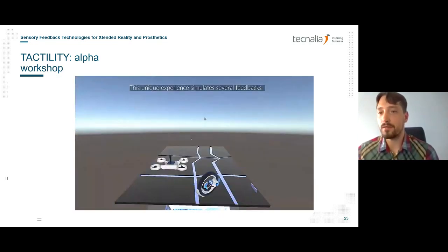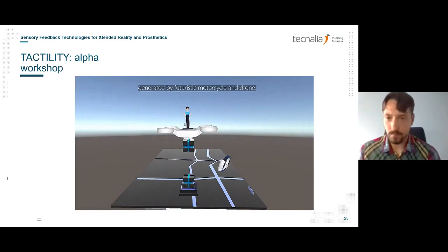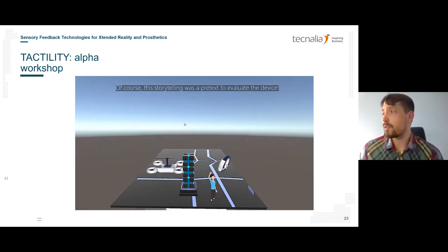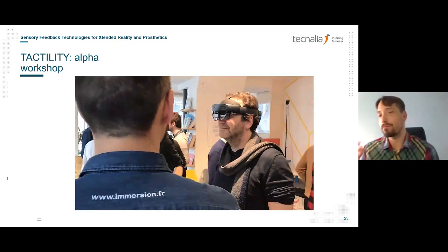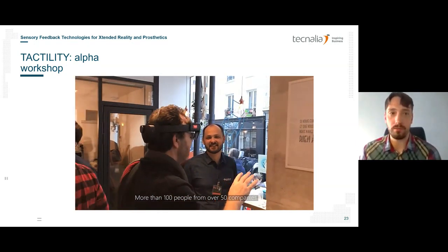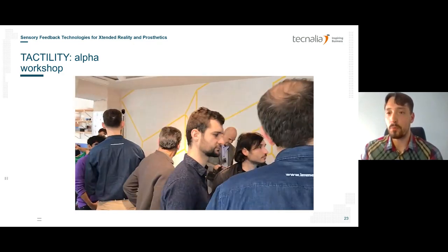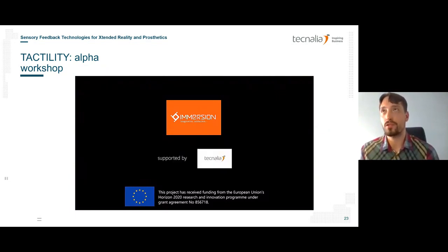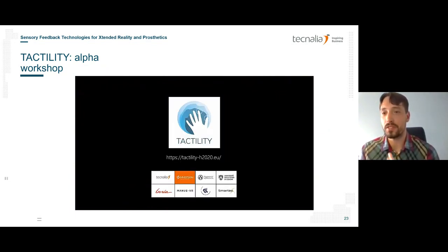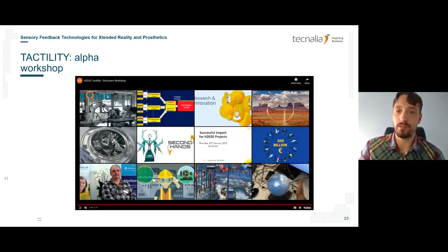What users can perceive, how much different information can be transferred via this channel, etc. And you can see here how this workshop looked like, where users were able to test this. But the message to take home: you saw that with those fingertip electrodes, users are really able to differentiate each separate pad on those electrodes, and now we are thinking about clever coding schemes in which the user can perceive this as a sense of touch, of touching the object in the most natural way.